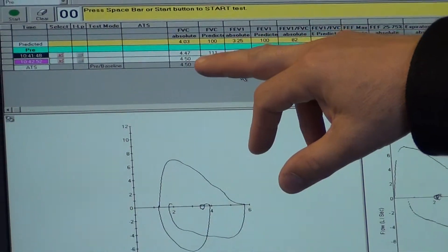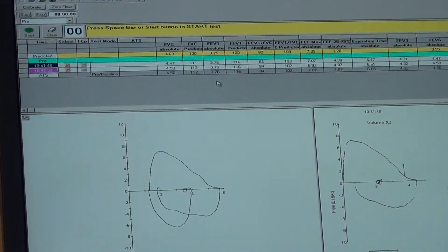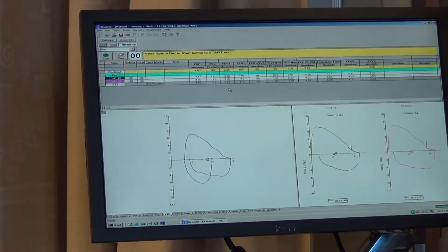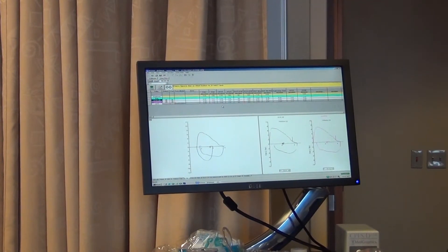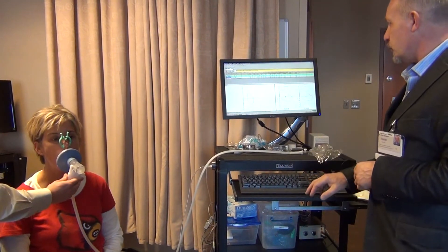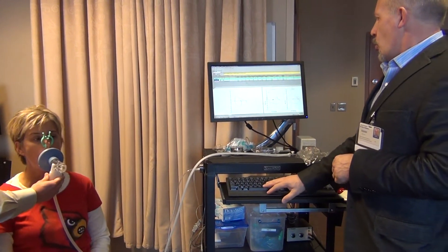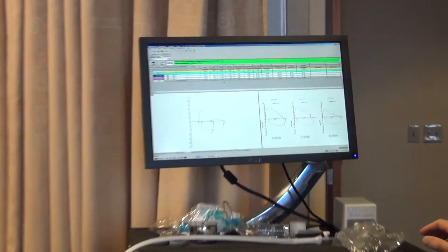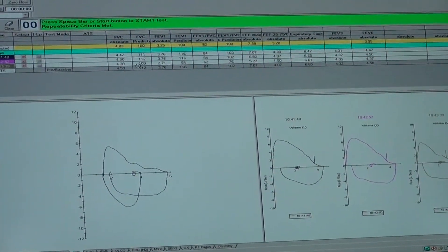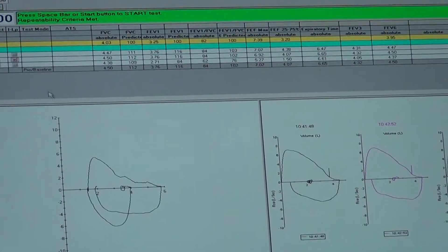We need another attempt close to the other two — within 0.15 and we're done. Are you ready to do it again? Let's do it one more time. Take it in. Push, push, push, push, push, push, push. Now we check the values and look for the best attempt. Check the FVC and the FEV1 and choose the one with the highest percentage values for both. Looks like attempt number two is the best.